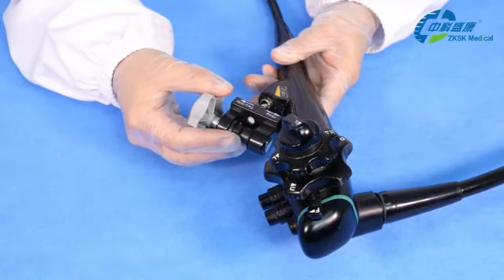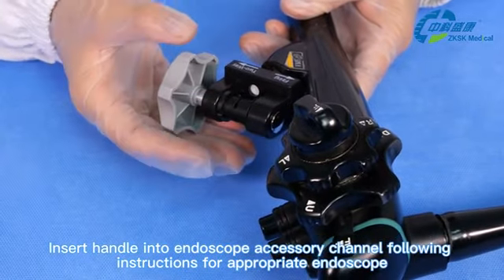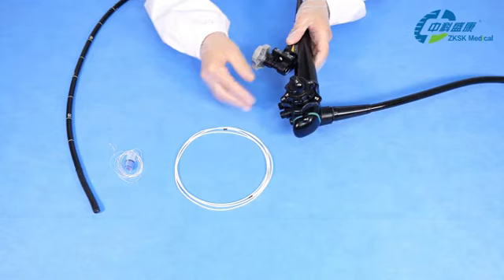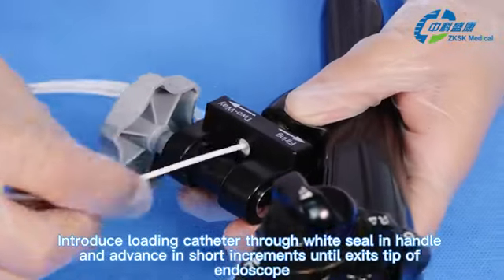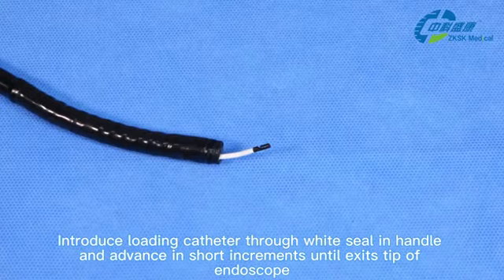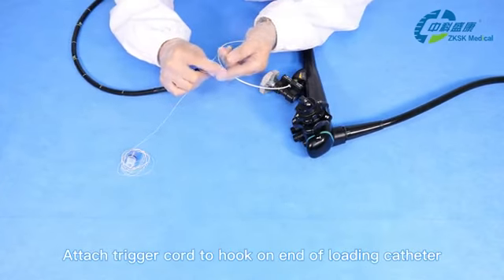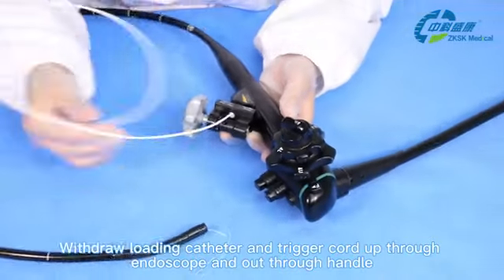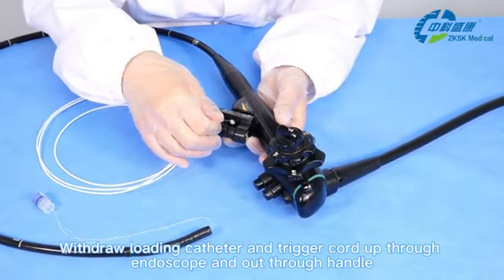Second, insert the handle into the endoscope accessory channel following instructions for the appropriate endoscope. Third, introduce the loading catheter through the wide seal in the handle and advance in short increments until it exits the tip of the endoscope. Fourth, attach the trigger cord to the hook on the end of the loading catheter. Withdraw the loading catheter and trigger cord up through the endoscope and out through the handle.